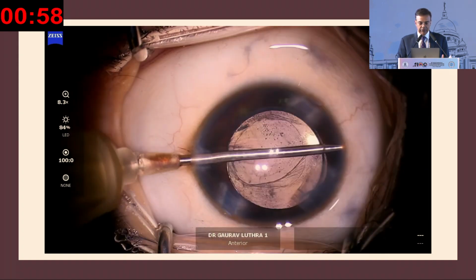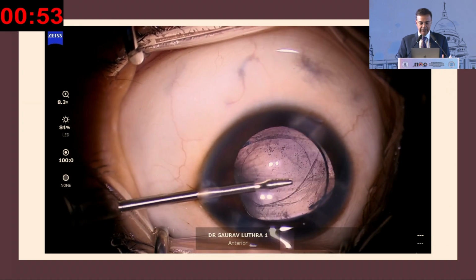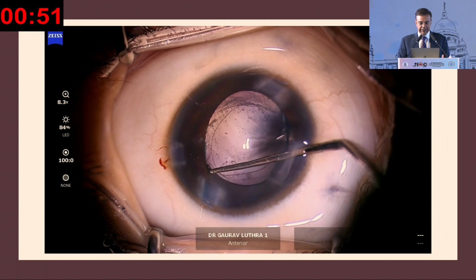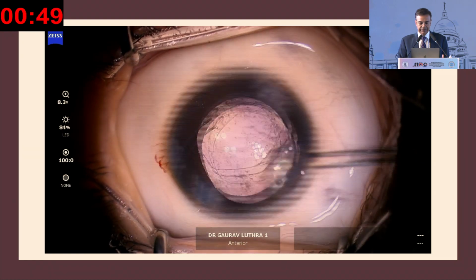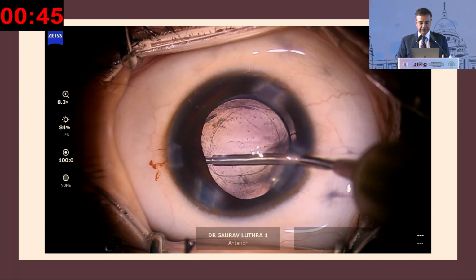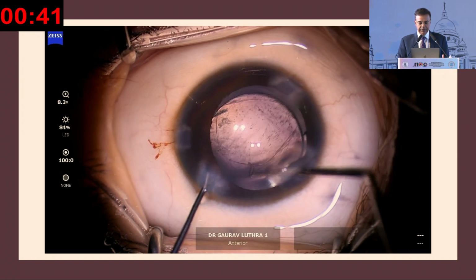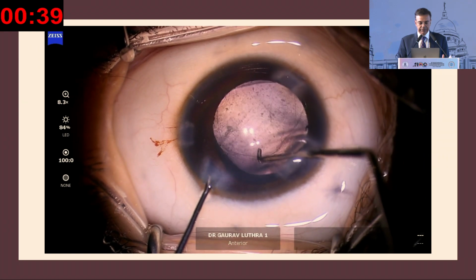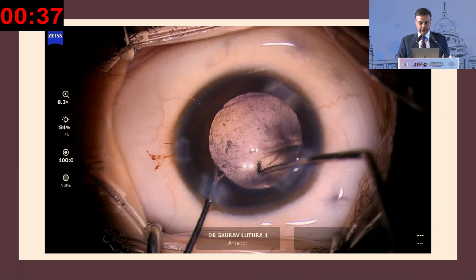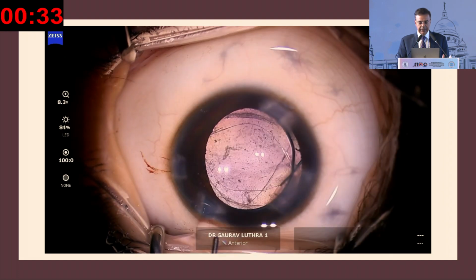See, I'm now holding with the forceps and placing the haptics into the sulcus rather than trying to dial it in. And once that is done, now I have to do an optic capture. So putting in the second haptic now from the other side. So the IOL is now nicely sitting in the sulcus, but to lock it in, I'll just do a capture. The optic capture will happen fairly easily, and now the IOL is locked in.